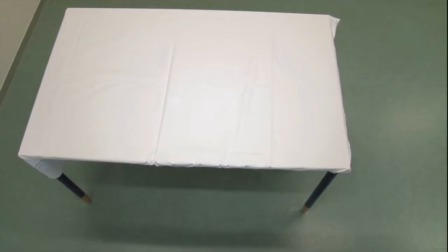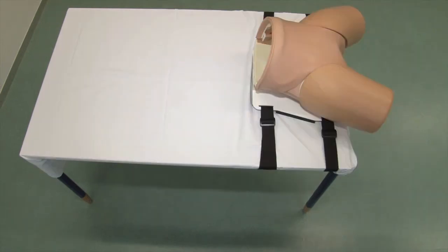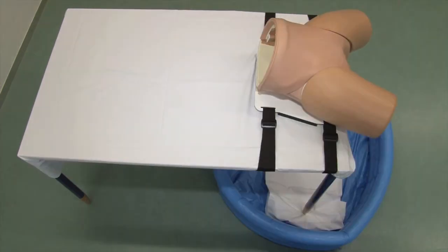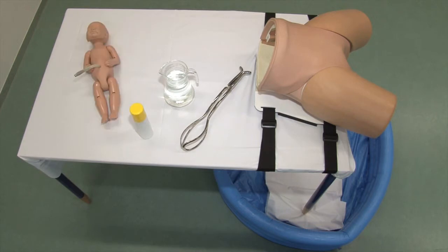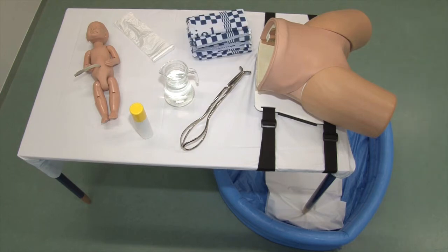For the setting of this simulation model, one needs a delivery bed or alternatively a small table, a waterproof pelvic manikin, an inflatable swimming pool, 1.5 to 2 liters of lukewarm water, a pair of forceps if one wants to practice a forceps delivery on the after-coming head, a lubricant silicone spray, a fetal manikin, thin plastic bags — for example dustbin bags — and a sufficient amount of towels.